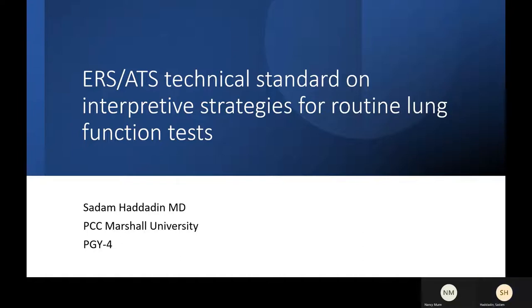What is a Z-score? Good question. Who's going to answer? Z-score, I think I got it correctly. It's something like the standard deviation, and it's different from patient to patient. So eventually the machine should give you a Z-score for the patient. So what is a Z-score of negative one?